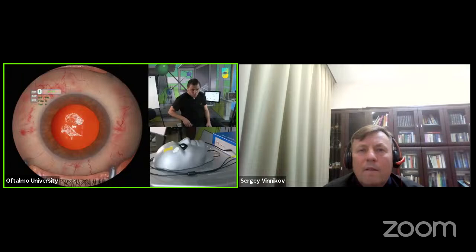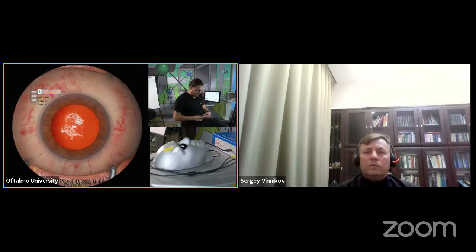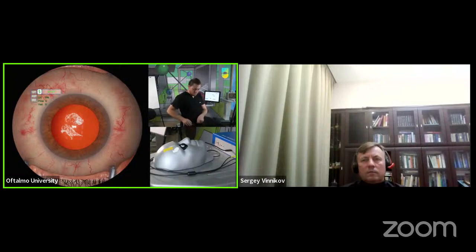Okay, now to finalize, we're going to do another type of workshop. We're going to ask our students, for whom anterior vitrectomy is completely new, and they're not trained in anterior vitrectomy. We just want them to face this scenario. This scenario is a posterior capsular break with vitreous in the anterior chamber.